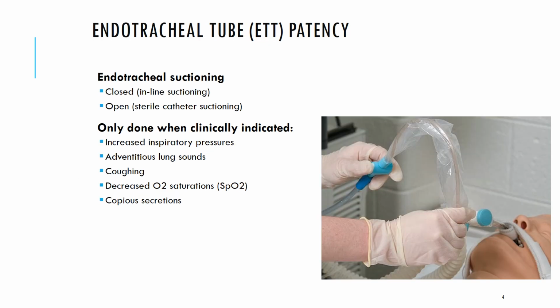So as we think about what it's like for a patient to be intubated and what our nursing responsibilities are, remember that this patient is likely sedated and we've bypassed their normal respiratory anatomy and physiology, and they are already sick. They were placed on a ventilator. So one of our roles is keeping this endotracheal tube patent, and sometimes it's a tracheostomy. Our patient may not be awake enough or strong enough to effectively cough up secretions, or those secretions may be so thick or so copious that they need help clearing them. So this is where suctioning comes in.